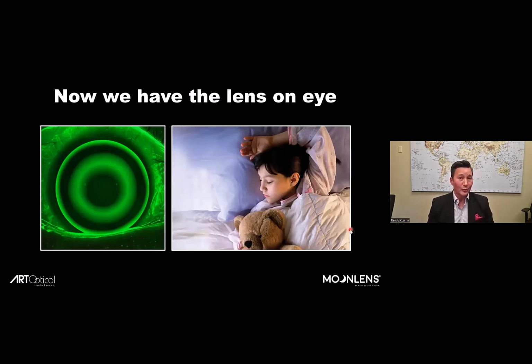And of course, I recommend doing that. But just keep in mind that the lens is not designed to work in the open eye. It's designed to work while the patient is sleeping. So if the lens looks dispensable, even if it doesn't look perfect, you should send the patient home with it.